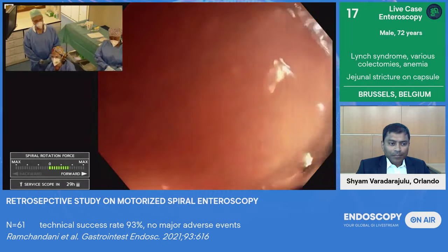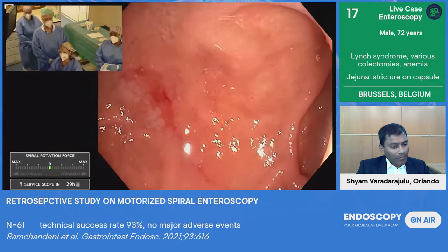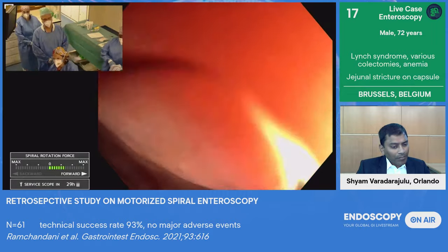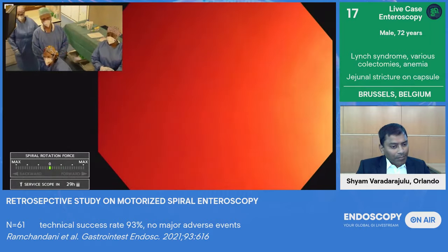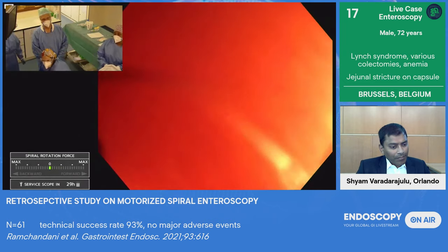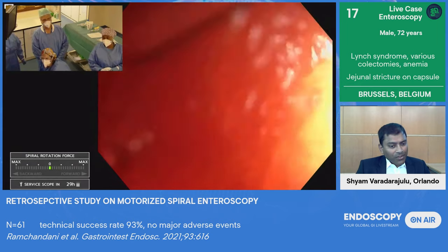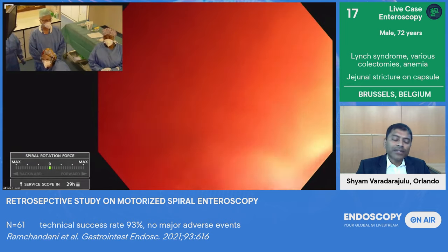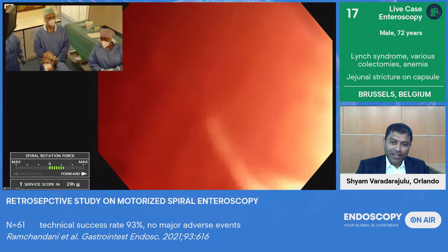One of the tricky parts of the procedure is to pass the Treitz angle and to pass the proximal duodenum. Here I'm still in the second duodenum, so that can also be a bit tricky. He had an angle here, and it's true that I had a bit of difficulty with the normal scope. So Jacques, in patients with surgical anatomy, is it particularly challenging to advance the endoscope?